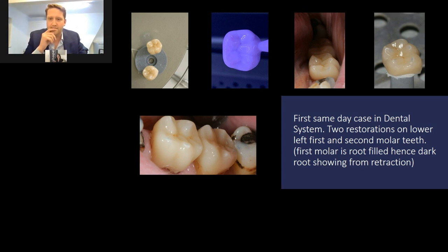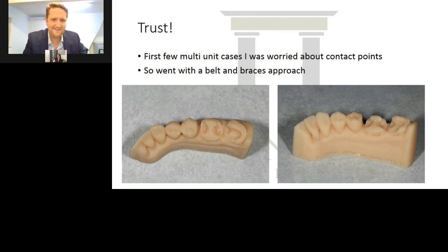There's a video of the design thing, but it's sped up, and that's 2 minutes, and I can't remember if it's double speed, but yeah, about 5 minutes, 10 minutes, dependent on how clear my margin is on the prep, and where in the mouth it is, and how accurate I want the occlusal morphology to be, and things like that. So yeah, usually 5 minutes is sufficient to design a crown. Then I do faff around with margins and then realise that I'm probably playing around with 10 microns, and it's pointless actually, faffing quite so much. At that point, yeah. It's not much point.